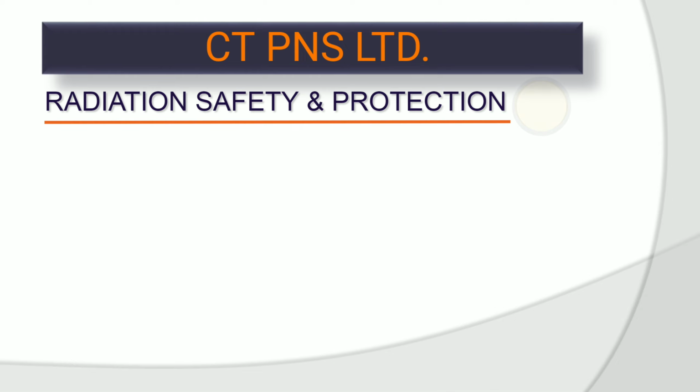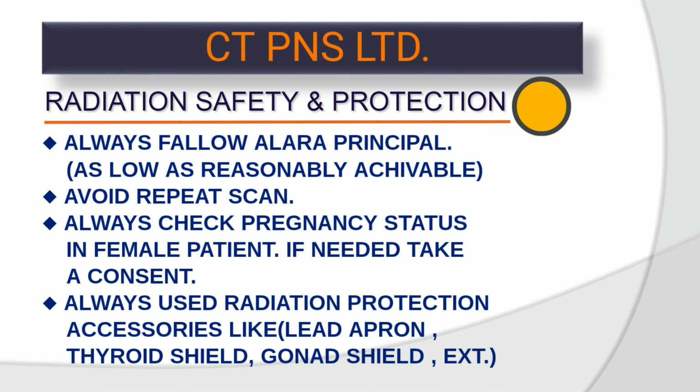Radiation safety and protection. Always follow the ALARA principle, as low as reasonably achievable. Avoid repeat scans. Always check pregnancy status in female patients. If needed, take a consent.